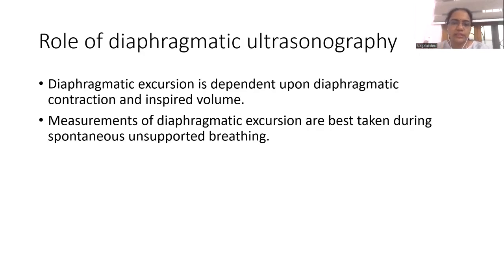Diaphragmatic excursion is dependent on the diaphragmatic contraction and inspired volume, and this can be used as a weaning predictor. Measurement of diaphragmatic excursion during spontaneous unsupported breathing can be noted, and the patient can be weaned according to that. Thank you.